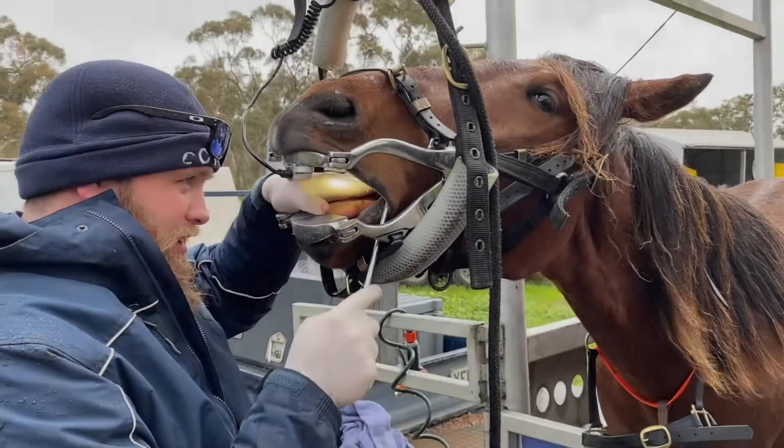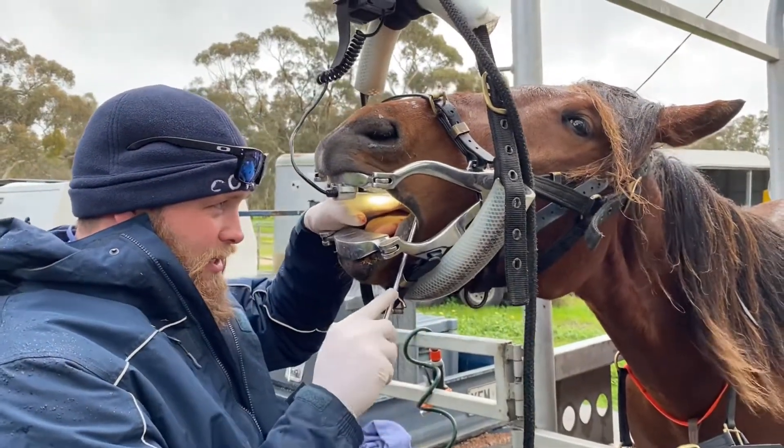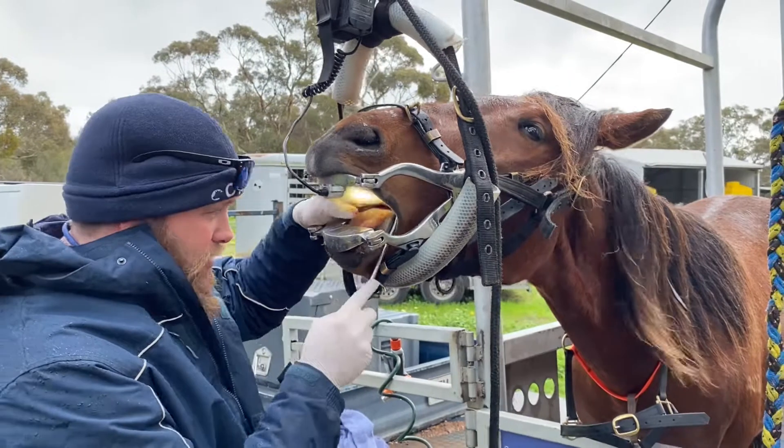That is without a doubt the biggest tooth I have ever taken. This is without a doubt the biggest wolf tooth I have ever taken out — a set of wolf teeth.